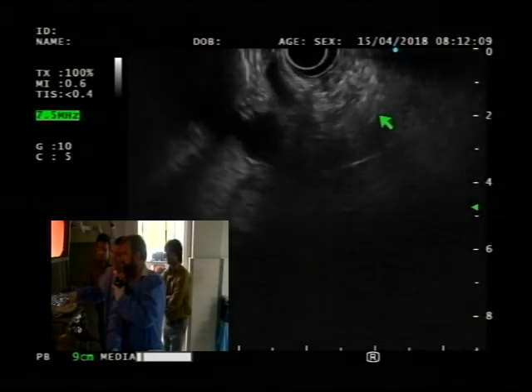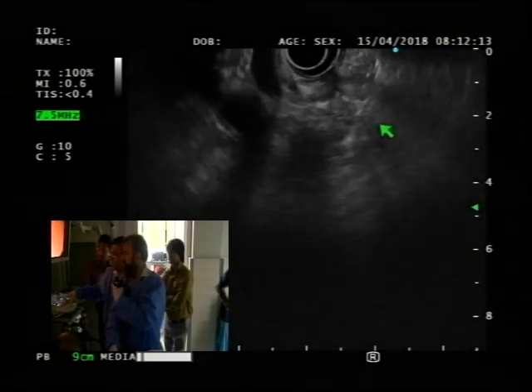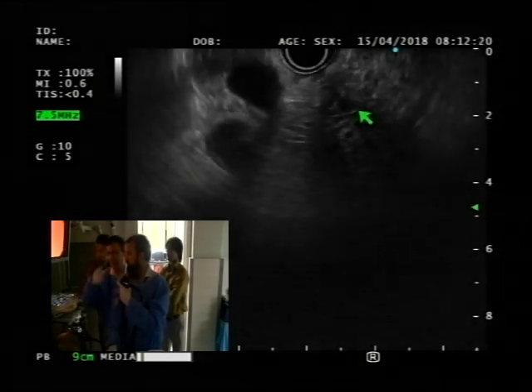Does anybody see any mass yet? The pictures are a little dark for us, but you may be able to see it, but we are not able to see. No, it's not very apparent yet. Yeah. Here either. Yes, so okay, let's go to the second part.